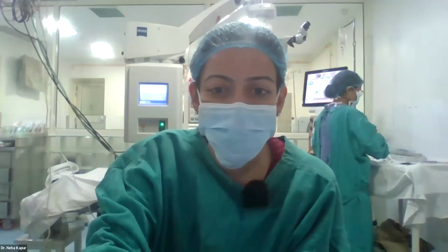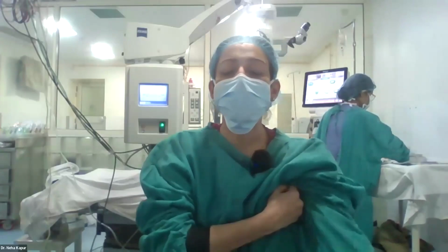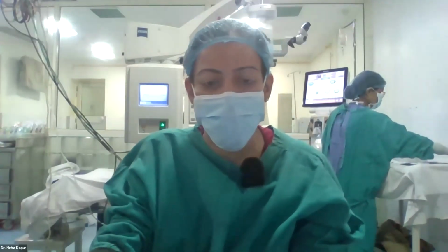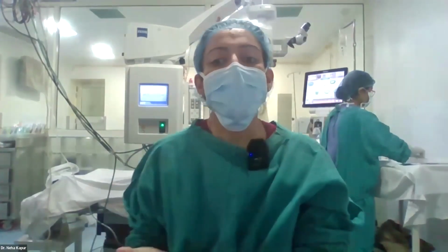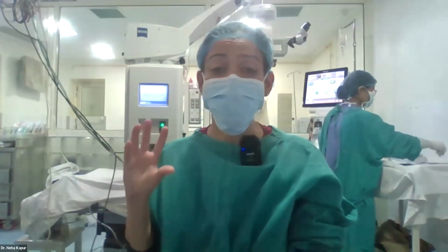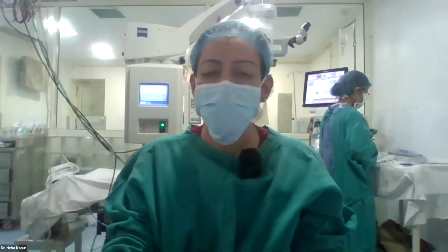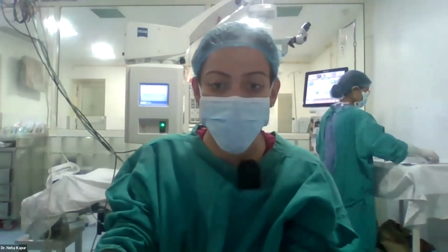How does the post-op IOP spike occur in DSAEK and what is the management protocol? So usually it's the first day, actually day 0, when you do expect trouble with pressure. And we don't really feel the need for mannitol to be given in controlled eyes like these. But if you have eyes that have issues with AC being formed, eyes that are not vitrectomized, eyes where you have complicated IOLs in place and you need to do an IOL exchange, we do like to give mannitol preoperatively. And post-operatively, usually in the first 6 hours, it's important to monitor the pressure. And if needed, repeat a mannitol for the patient.